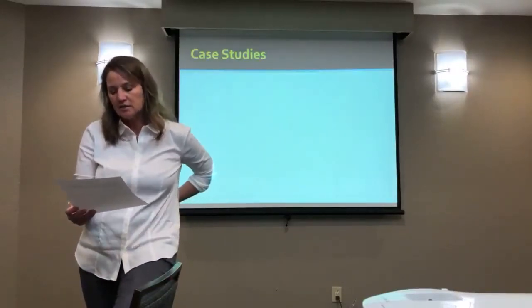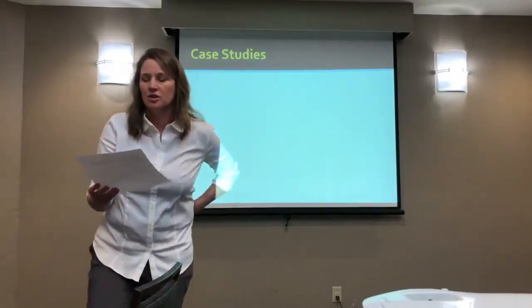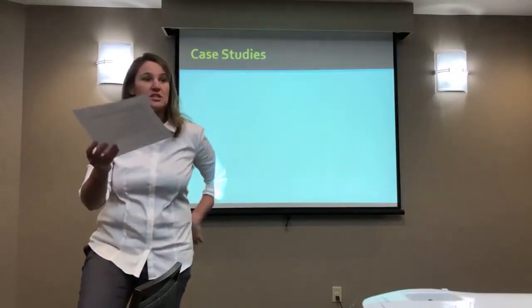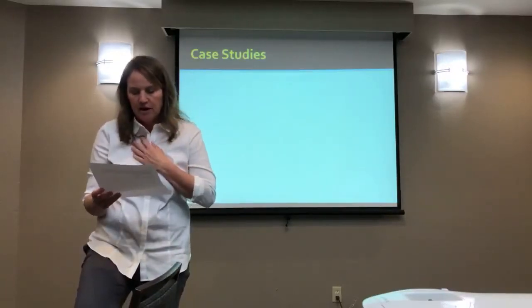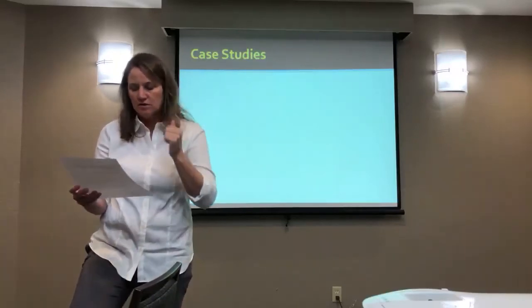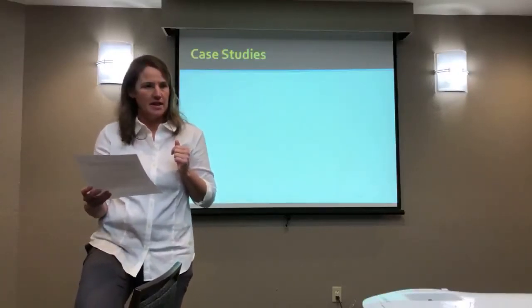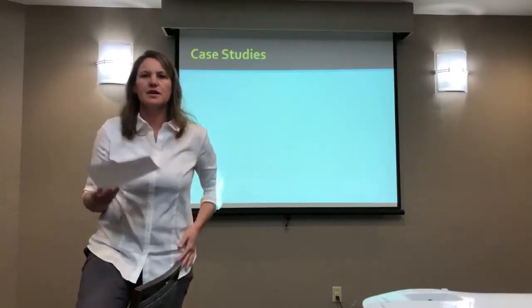Okay, so this one has, what are we gonna do? Could we do ultrasound? Do you think it's indicated? Sure. How would you use it? 1 megahertz. Would you go continuous or pulsed? You're going for heat? Absolutely heat, yes. I agree. So you're gonna go for continuous, 1 megahertz, and 1 watt per centimeter squared. I like it. Maybe 5 to 7 minutes.